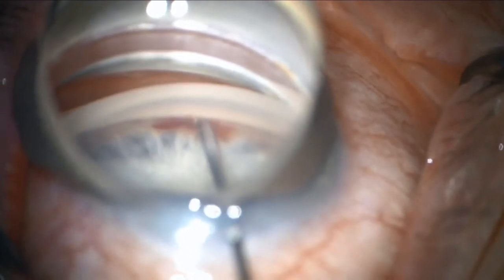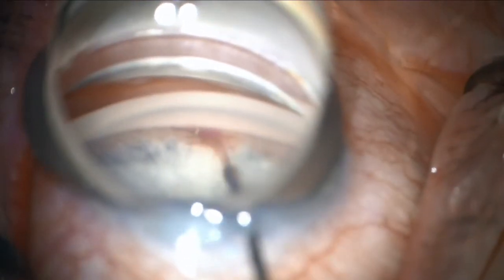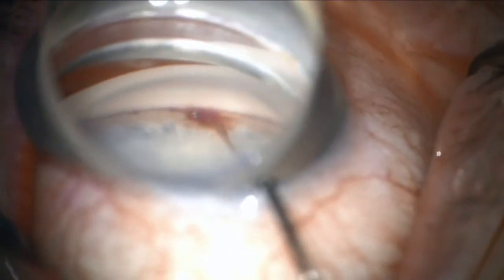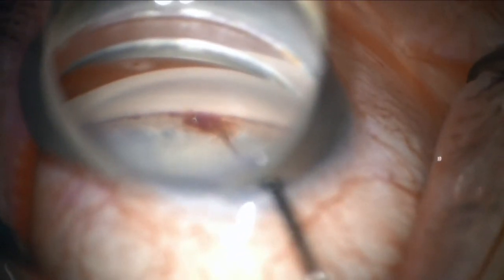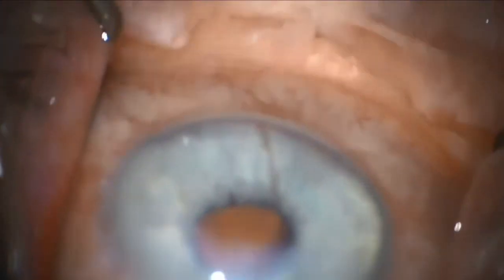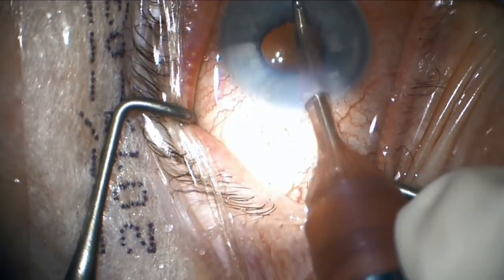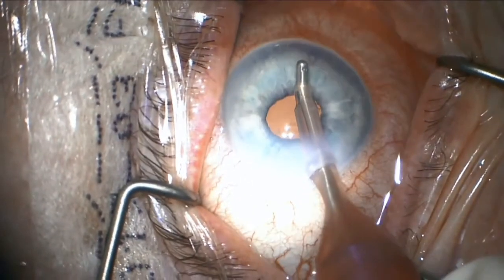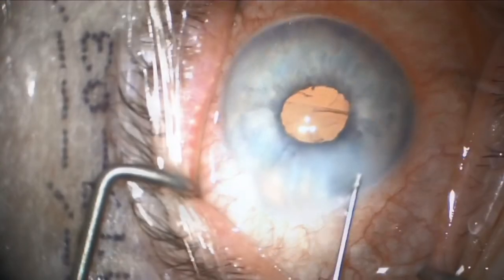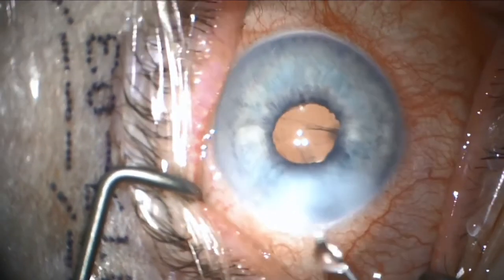We tap the eye stent with the injector to make sure that it's well-seated. The little bit of heme that we see is actually a good sign — that's a sign that we're in Schlem's canal and there's a little bit of heme reflux. We remove the eye stent applicator and the gonio prism, then tilt the patient's head back and finish removing the viscoelastic with the aspiration tip, sealing up the incisions at the end like we would with any regular cataract surgery.